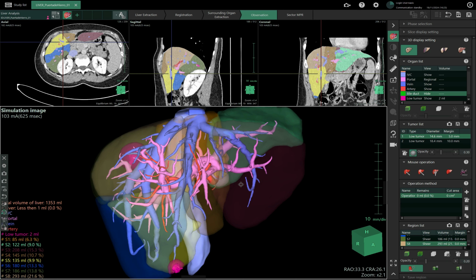But we don't know how much time the doctor or the radiographer or whoever did the extraction and segmentation worked on that. Maybe they spent 2 hours, maybe more, because we have this software in another hospital in South Madrid, and they use it for manually done segmentation. All verified, done by radiographers and overseen by radiologists. They print everything and send it to many other doctors in Madrid for planning their surgeries. And they told me that this is precise, this is correct.